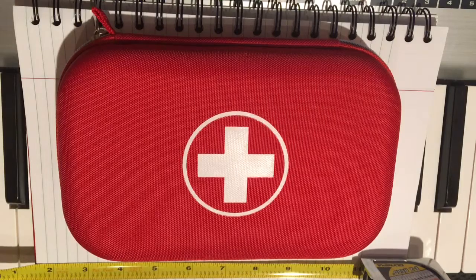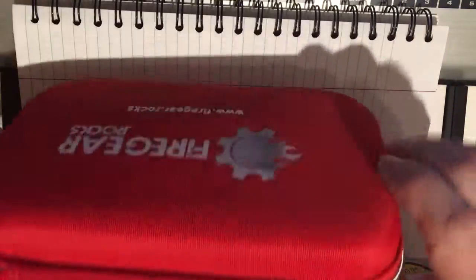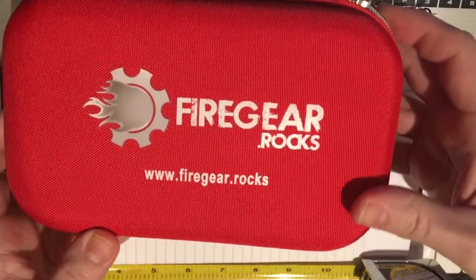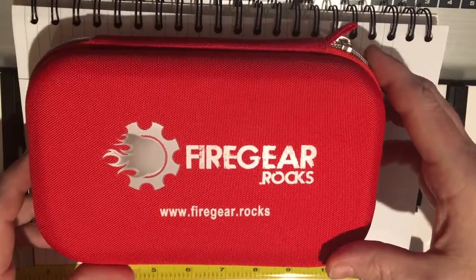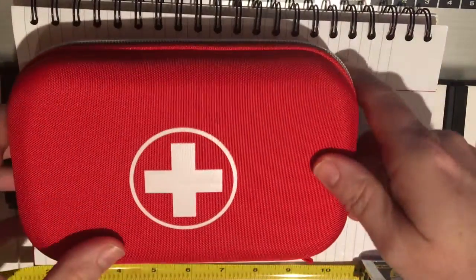You guys may have seen these on Amazon. They're labeled 'best first aid kit' and the one thing that sort of separates them from some of the other ones that are red is this right here — it says 'Fire Gear Rocks' so you'll know this one from some of the other ones. This was around seventeen dollars.